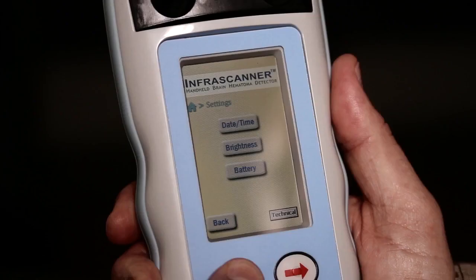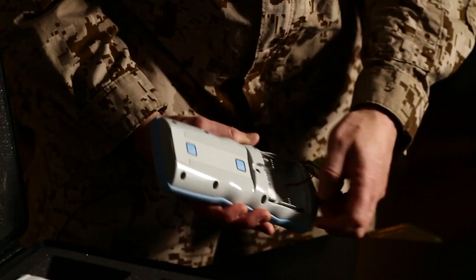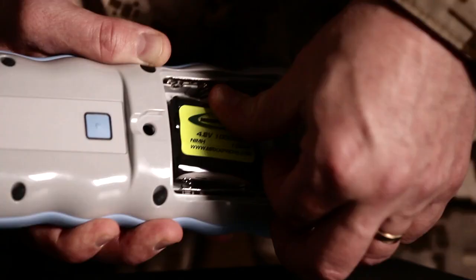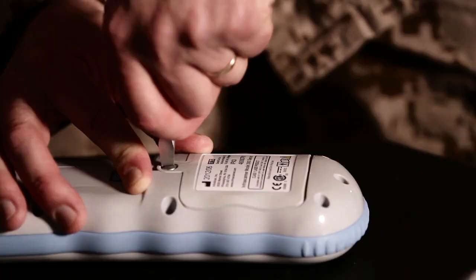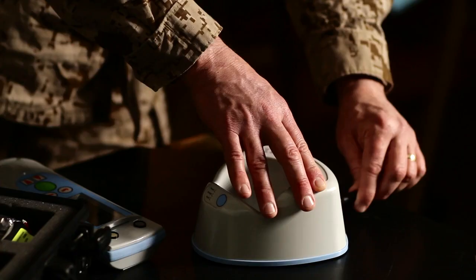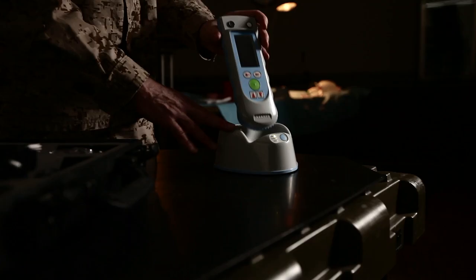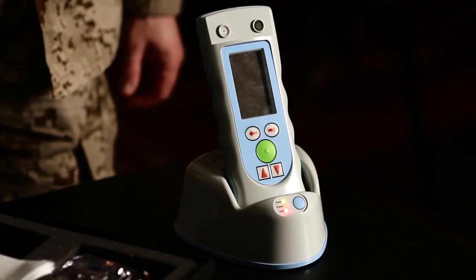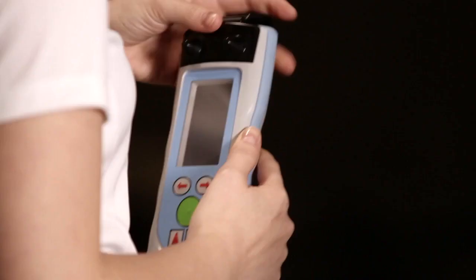You can also navigate to the settings screen which will give you the percentage of battery life remaining. In the event you're in a clinical or hospital environment with a power source, you have the option to use the rechargeable batteries within the Infrascanner. Once you plug in the device it's going to blink. For 10 seconds you may insert the Infrascanner into the cradle. The orange lamp will blink and you will know the Infrascanner is charging. If disposable batteries are in the Infrascanner, the red fault light will come on.